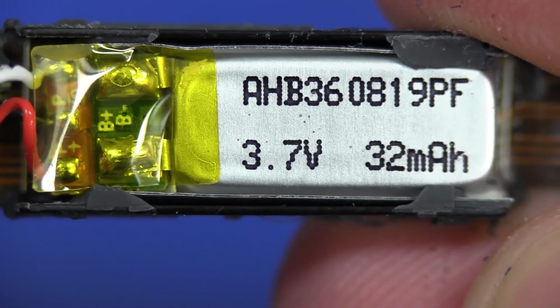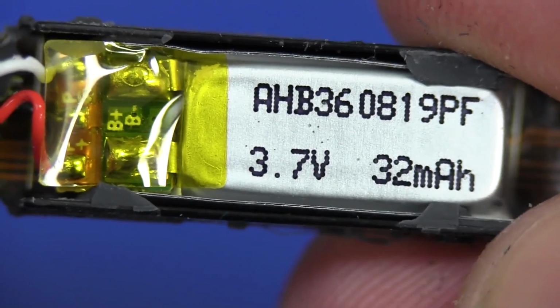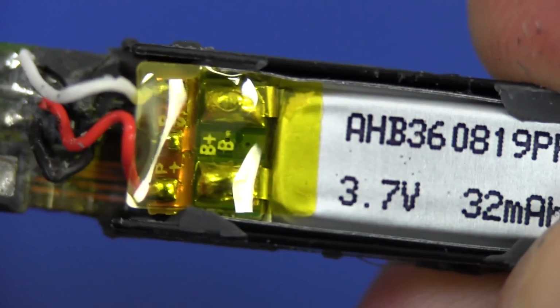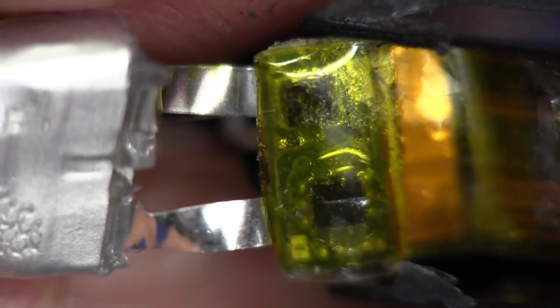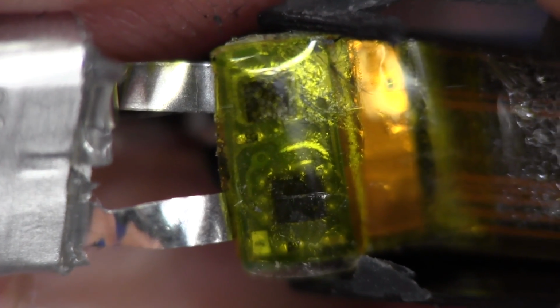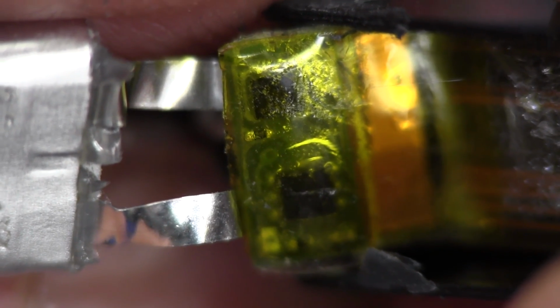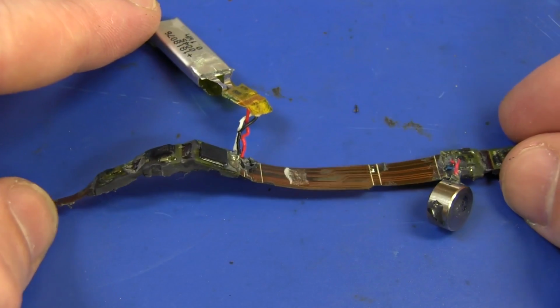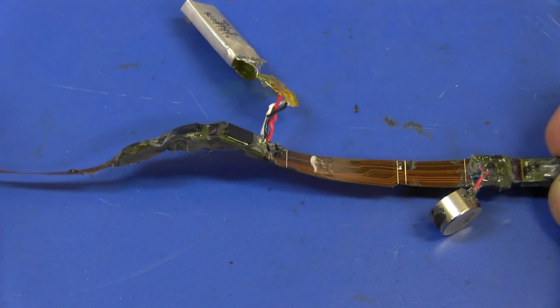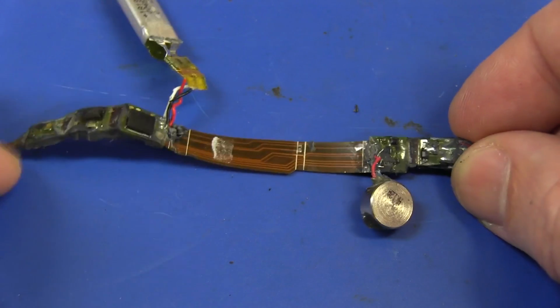Ta-da! Finally cracked it. There it is. Yep, lithium polymer, 32 milliamp hour, single cell, 3.7 volts, with what looks like possibly a battery protection board in there as well, as you'd expect. And there you go, there's the back side of the battery protection PCB, and you can see the MOSFETs in there for the over voltage cutoff, and probably under voltage cutoff as well. And there you have it, it's completely out, and you can see the rigid flex architecture with the different boards all joined by the one flex membrane in there.